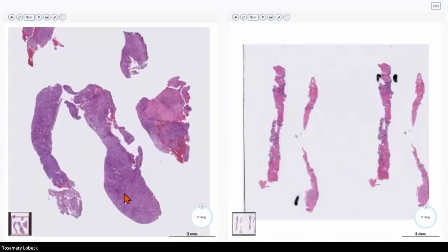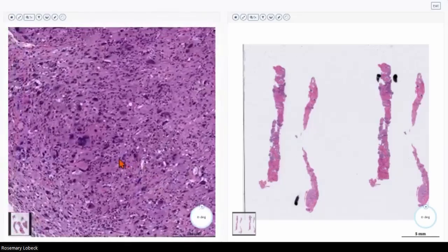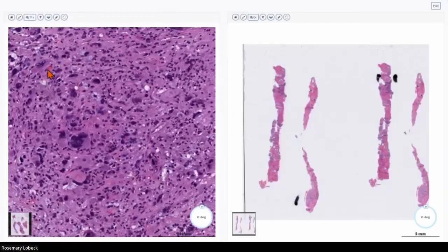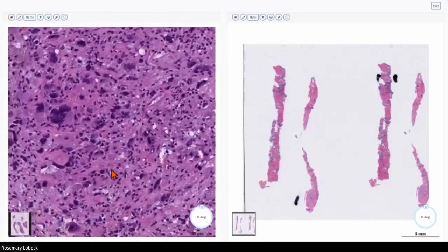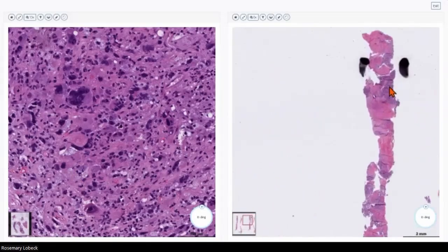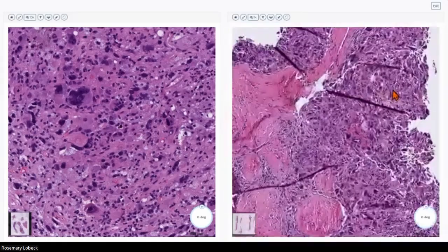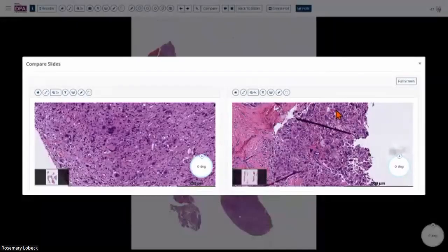So I want to zoom in to anywhere on this high-grade pleomorphic sarcoma, right? And you see highly atypical mitotic figures, and then highly pleomorphic cells. But you also see areas that have somewhat of a histiocytoid cytoplasm, like we saw in the other case, right? That foamy cytoplasm. So if you zoom in to this lesion, you know what you're going to see. You're going to see something that is very, very similar to this high-grade pleomorphic sarcoma, another huge pitfall. So the clinical context is so key in diagnosing these types of lesions correctly.